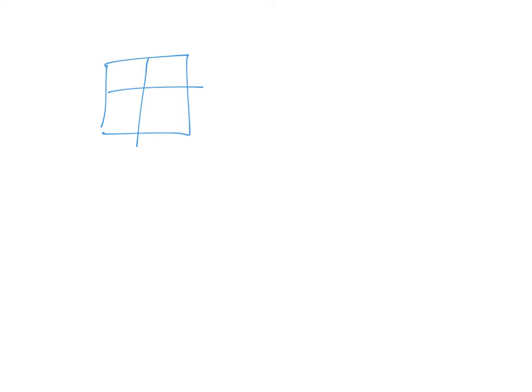So the first assumption we are going to make to keep the calculation simple is, imagine you guys were like a SpongeBob shape, like a square. So if I were to cut off one slice of your face, you will be like this square. And let's say each of these big boxes that you see here are called voxels. So we call it 4 voxels. Let's imagine that each voxel represents a number. So what number does it represent? The bigger the number, the more is absorbed by the X-ray, more is absorbed by the medium, so therefore it produces a lighter image.